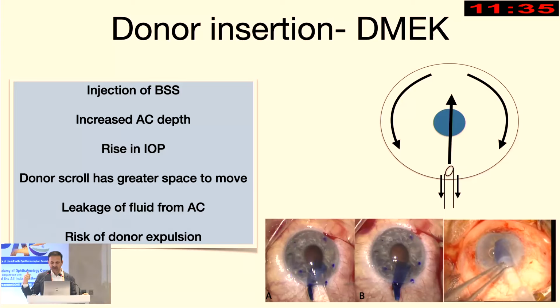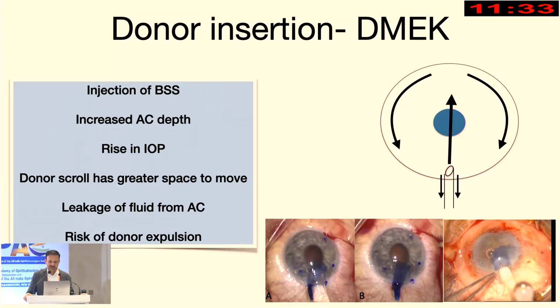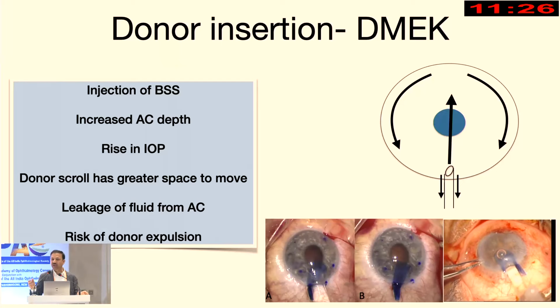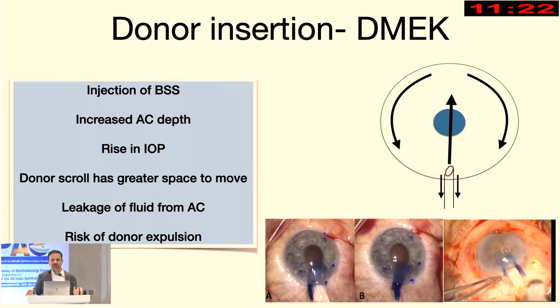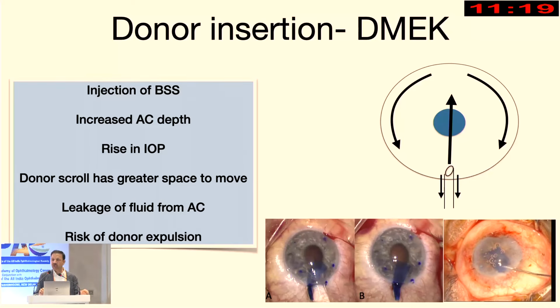Now here you can see that when you're trying to insert, if there is increased fluid pressure, the tissue can come out. This also happens when your speculum is very tight, or you have given a peribulbar block and there is too much external pressure. That upthrust also causes the AC to shallow, or you have made a wound that's larger than the tip of your injector. So sizing is very important.